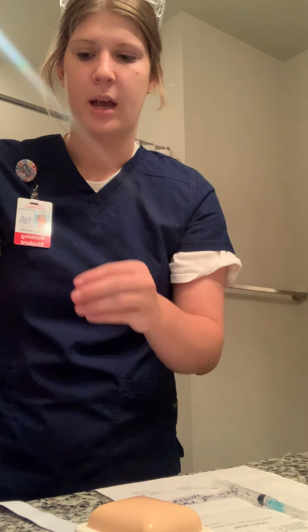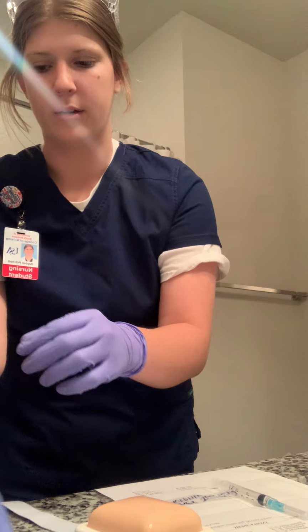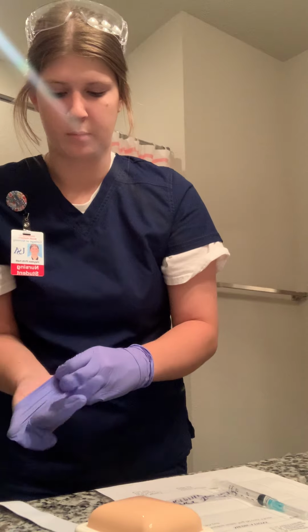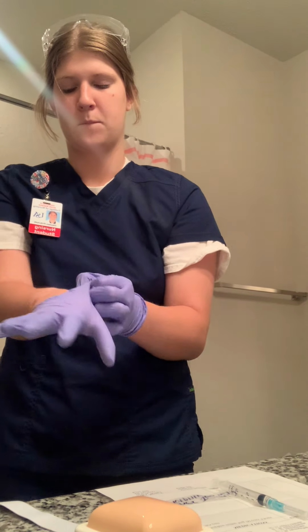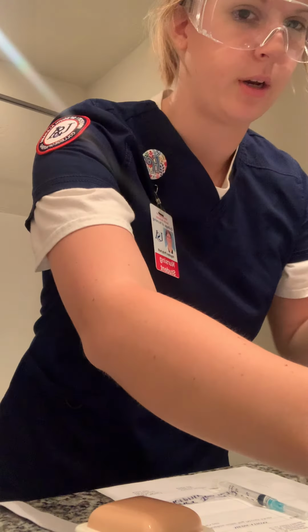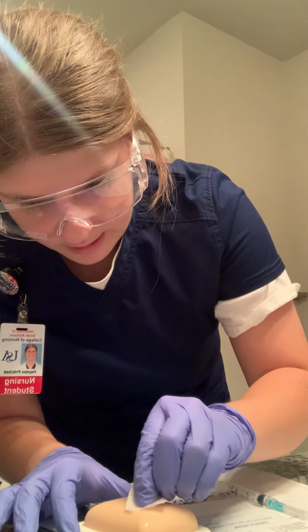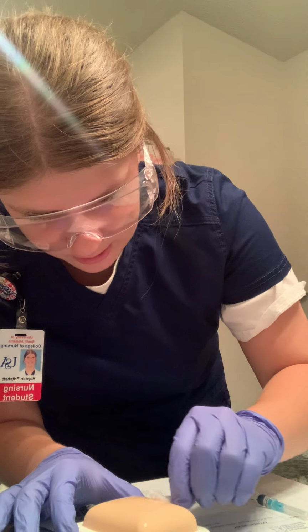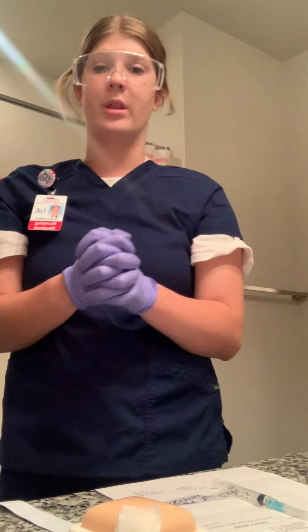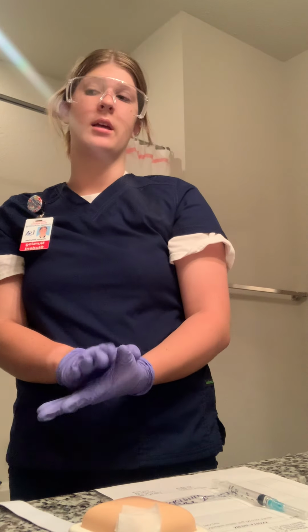So now that I know I have all the rights, I'm going to put on my gloves. I'm going to put on my goggles. And I'm going to open an alcohol swab. Put that away. I'm going to clean the area, making sure there is no bruising, and I'm checking the area to make sure it's okay to use. And we will be doing this on the ventrogluteal site because that is the ideal spot for IM shots.